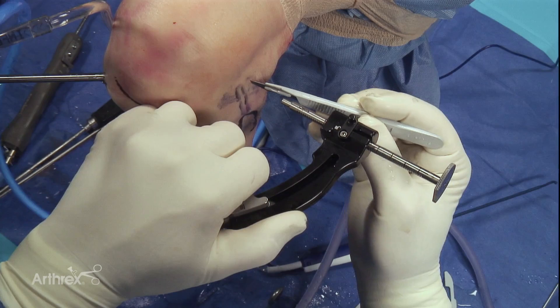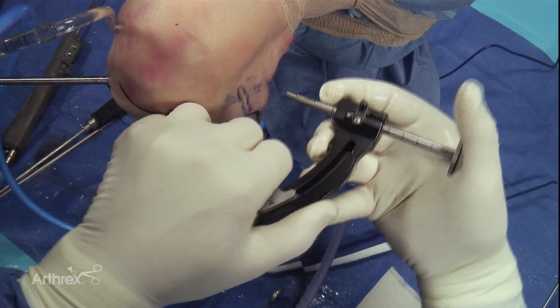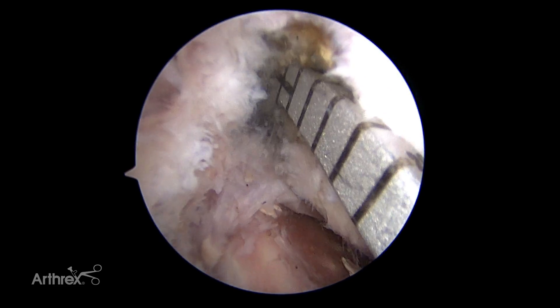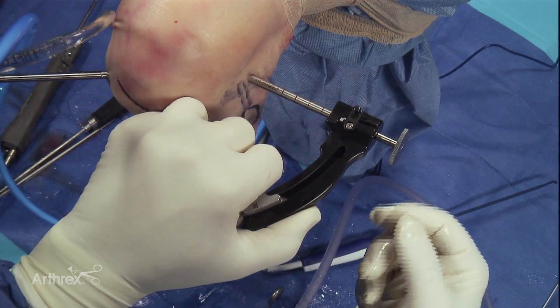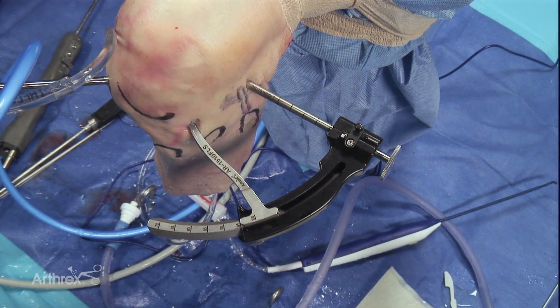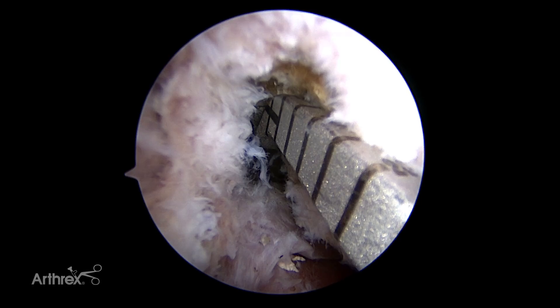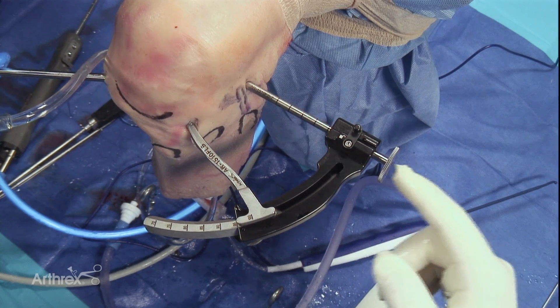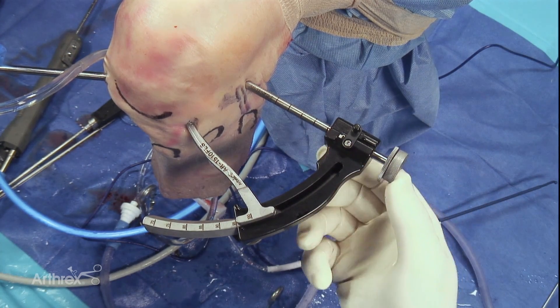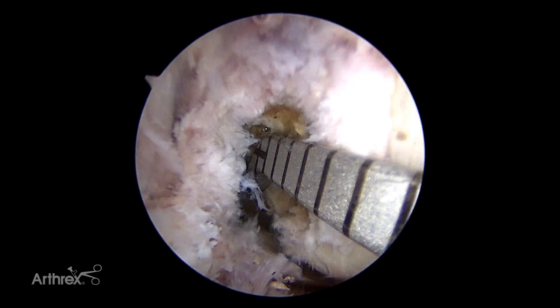I'm making a small puncture wound right here. Advancing the guide, I'm going to check the aperture again and make sure I'm happy with where I am. You do have an opportunity to use a guide pin through this sheath if you'd like. Notice I've turned the ratcheting mechanism such that it can lock, and that gives me a very stable position — in fact, I can release my hands in this position. I could not have done that with the first generation guide, so I think that's an important feature. One could choose to use a narrower diameter sheath which fits into this larger diameter sheath, and if you were concerned about where you were going to come out, I would use a small guide pin and be certain that I was happy with the position of the guide intra-articularly and the location of the pin once it came through.